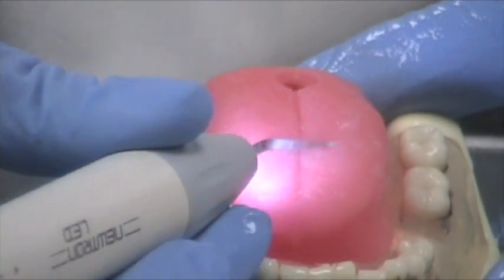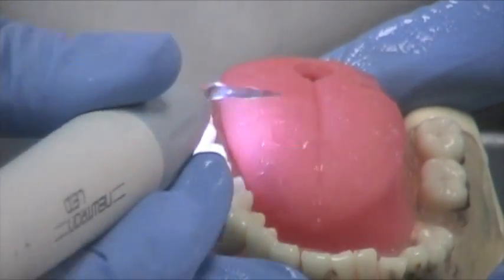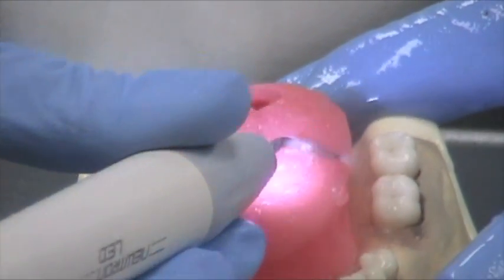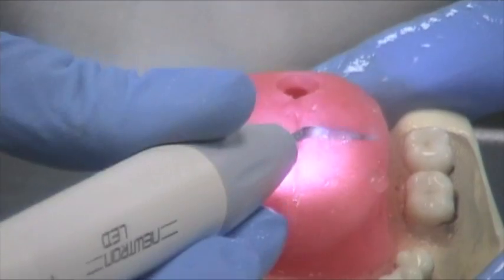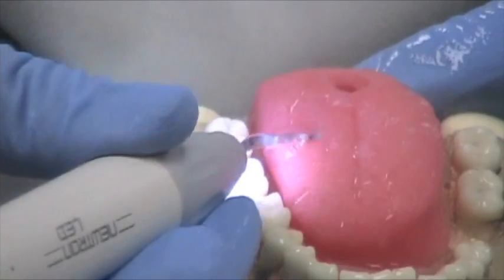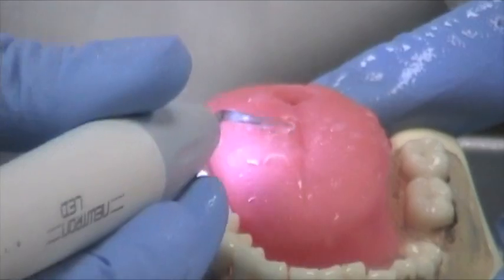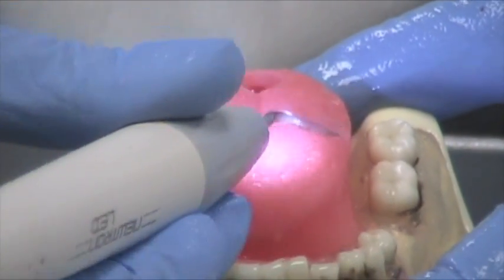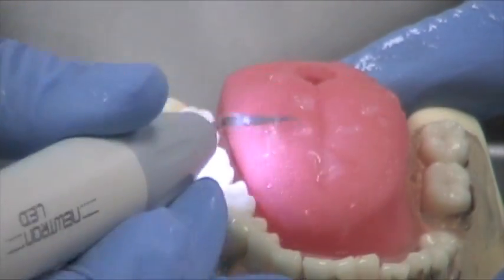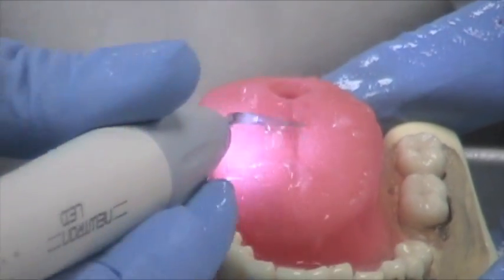We are supposed to be teaching patients how to brush their tongue and do tongue scraping. It's a really added value when you can add this to even your regular patients as well as your non-surgical periodontal therapy cases. And when you get this far back on the tongue — believe it or not, you can go this far back, especially with this satellite unit — you have so much less water to deal with that the patient is not gagging at all. You don't have to worry about the water splattering up to the gag reflex. When you get towards the back, you're actually removing the volatile sulfur compounds, and that's what's causing bad breath. So patients are really, really appreciative of this.